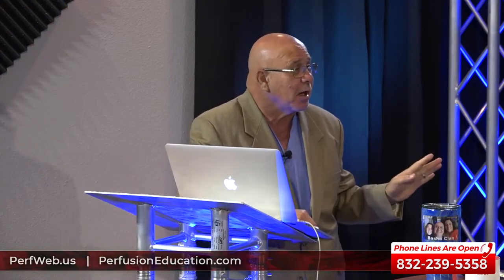I really don't know. Yes, it may be, but I wouldn't think it would be, because we are literally talking, like you said, 5 liters to 0, 5 to 0. And then on the other side, even though they say come up slow, you're taking that clamp off. So even if you bring your RPMs down, you're still getting a sudden resurge of flow.